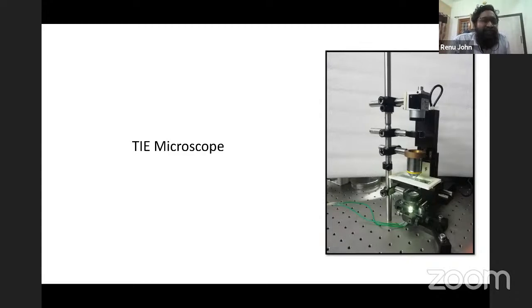In fact, I call it optical coherence microscope, OCM instead of OCT, compared to these types of holographic microscopes. I can do a tomographic image about a millimeter on the surface, especially in the oral cavity. So you can have a handheld OCM probe which looks at the surface of the oral cavity. It is much easier that way rather than taking the smear onto the slides.